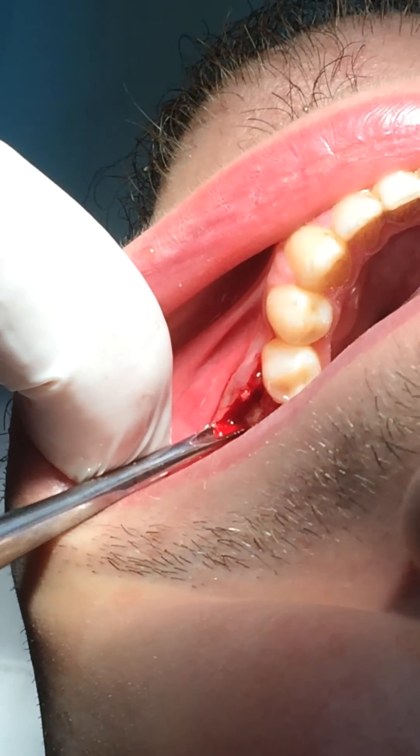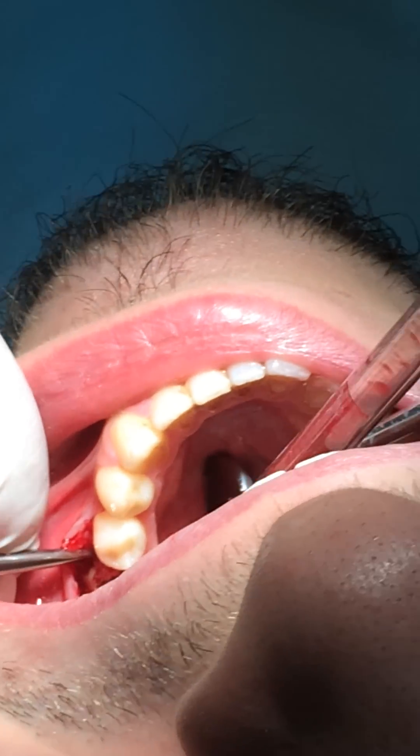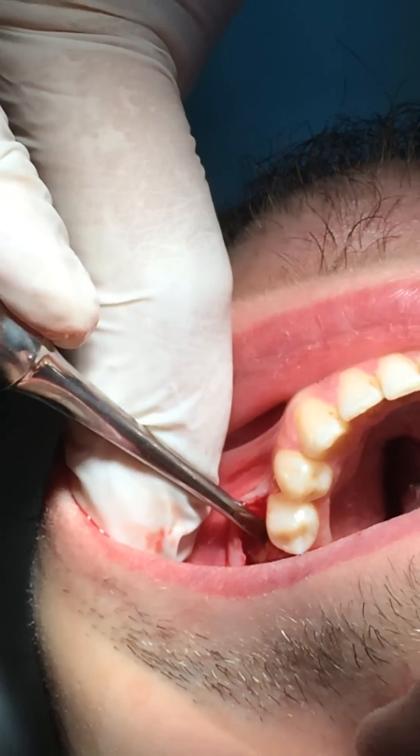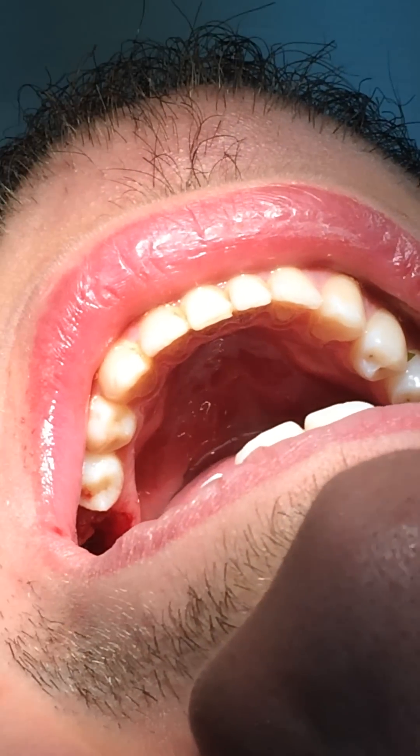Now, after reflection, we'll try to remove the mesial roots. Can I have a large size — blade number two? Because this is the worst part, the mesial. Yeah, number two is the worst.